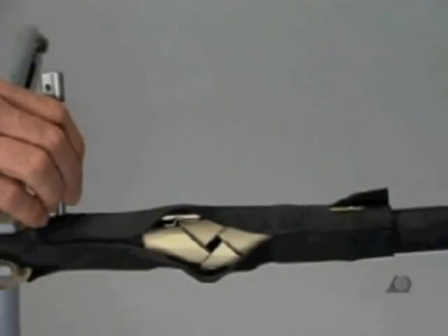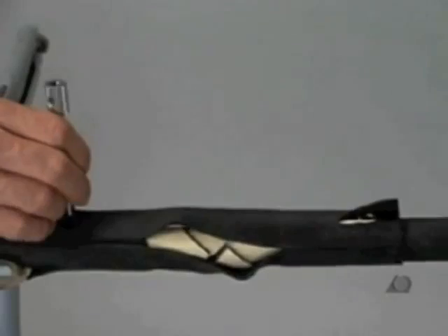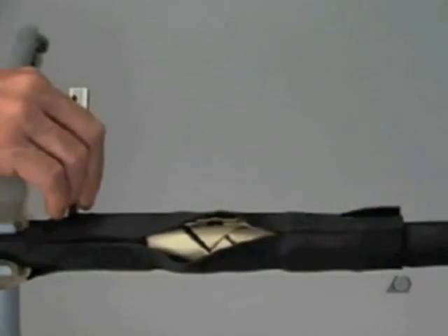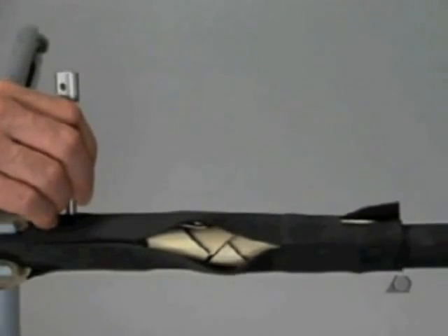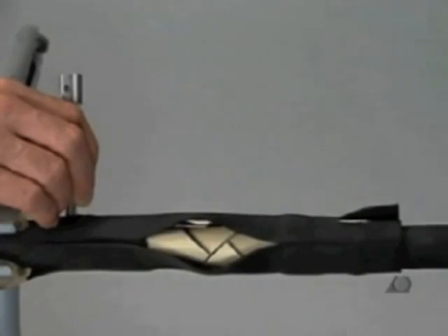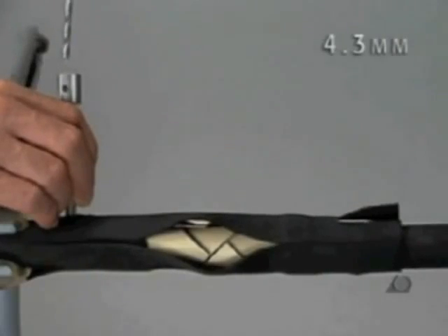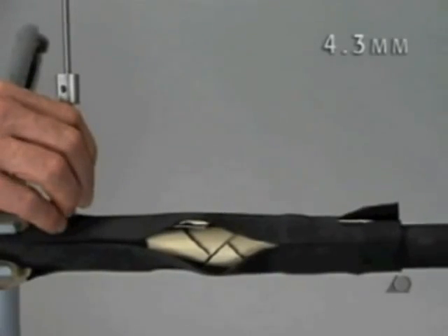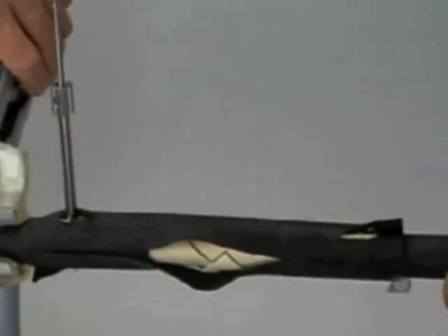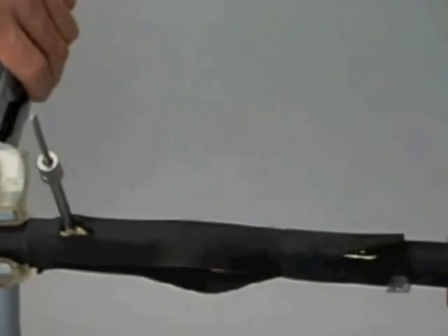Minor reduction adjustments can be performed indirectly using the drill sleeve. Once correct reduction has been achieved, the 4.3 millimeter hole for the locking screw is drilled. The drill bit has to be left in place.